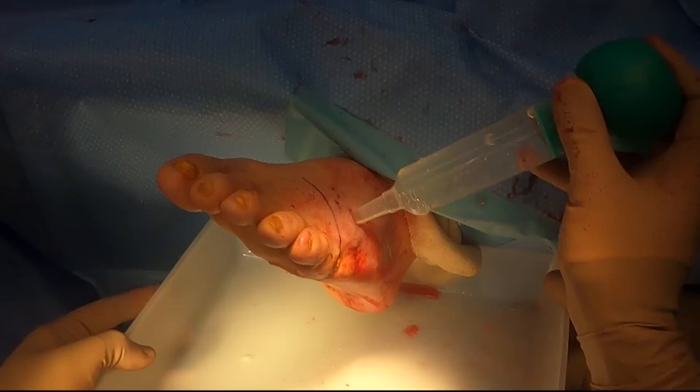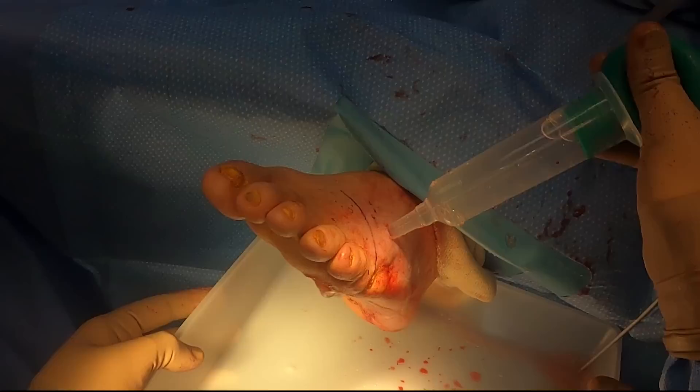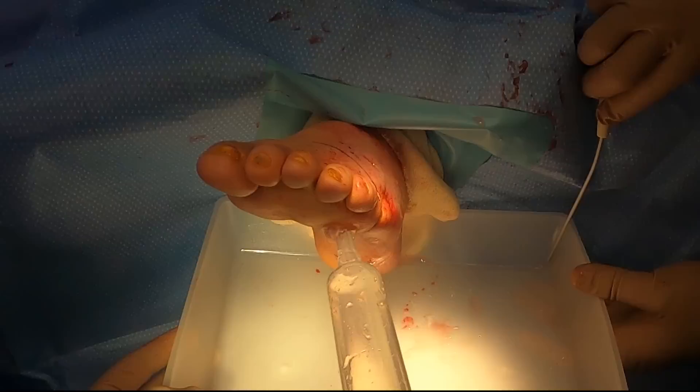We want to irrigate as much as possible with normal saline. This just helps wash out any debris and necrotic tissue. A good flush is always important after a resection of bone for osteomyelitis.